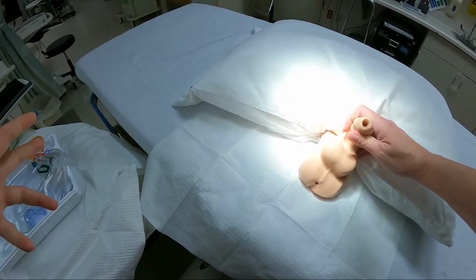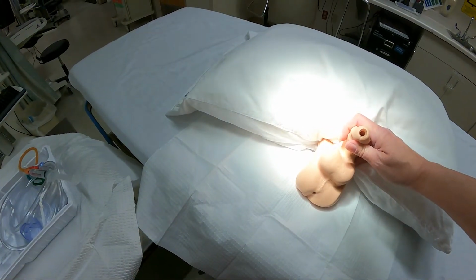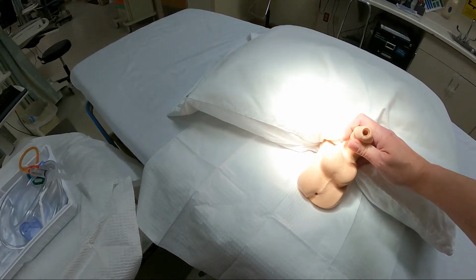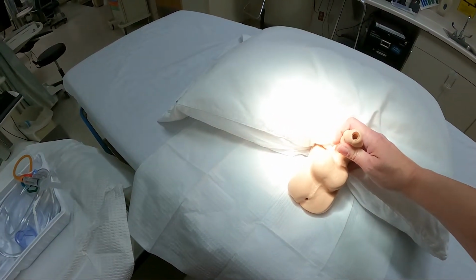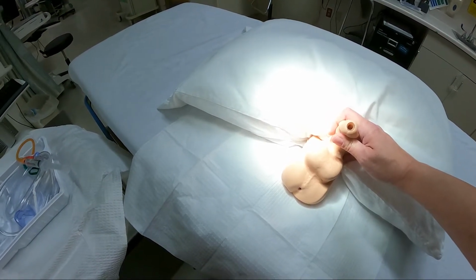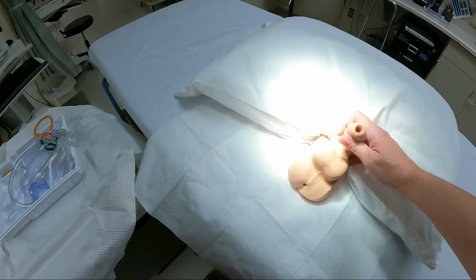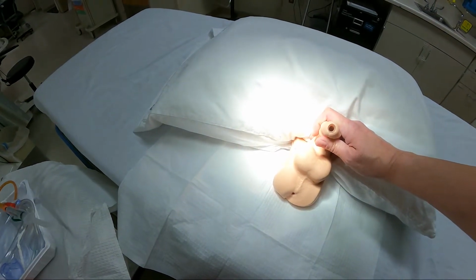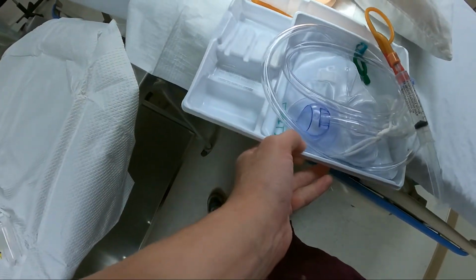Now, of course, back to the cleaning part. After you clean them up, especially if they are not circumcised, or haven't done a lot of personal hygiene for whatever reason, elderly, obese, or doesn't feel like it, you need to do that first. Then use the Castile soap, also with foreskin retracted, and clean with the Castile wipes before you do the iodine swabs. So iodine swabs are last. Now, you again move everything over here, same setup as you do for the female catheter.